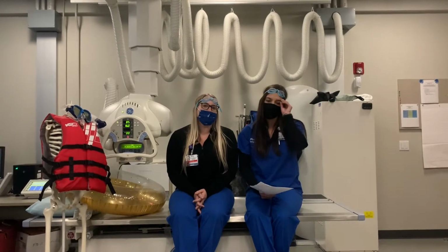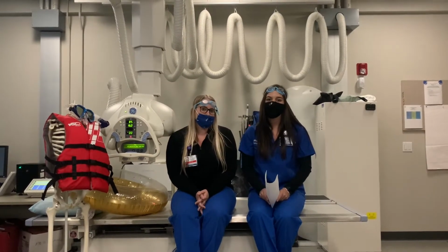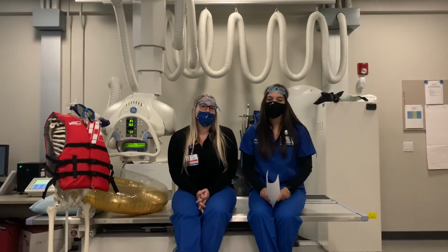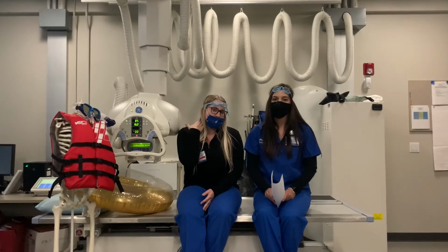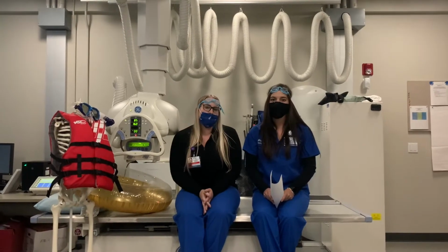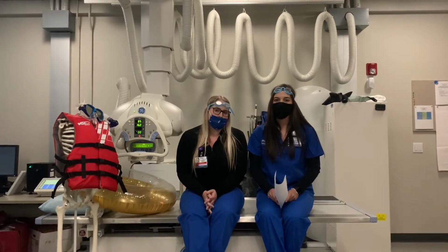Demonstrating for you the lateral projection of the cervicothoracic region, also known as the swimmer's technique. The swimmer's technique is done when you've done a lateral C-spine and you're unable to see the C7-T1 junction. It can either be done supine or upright, depending on the condition of your patient.